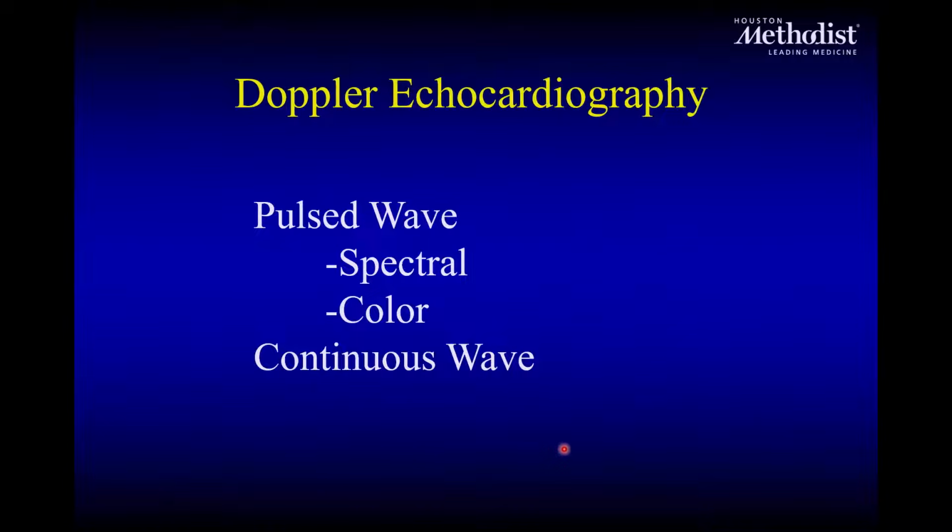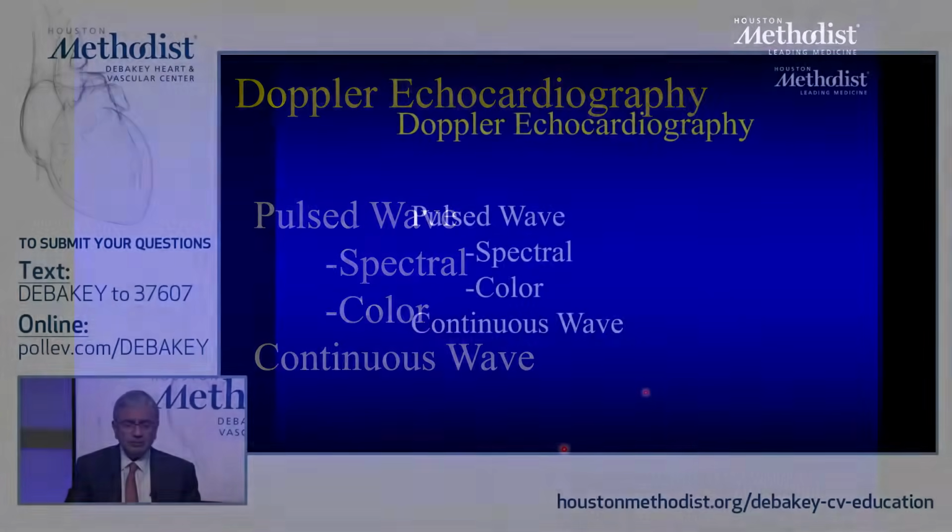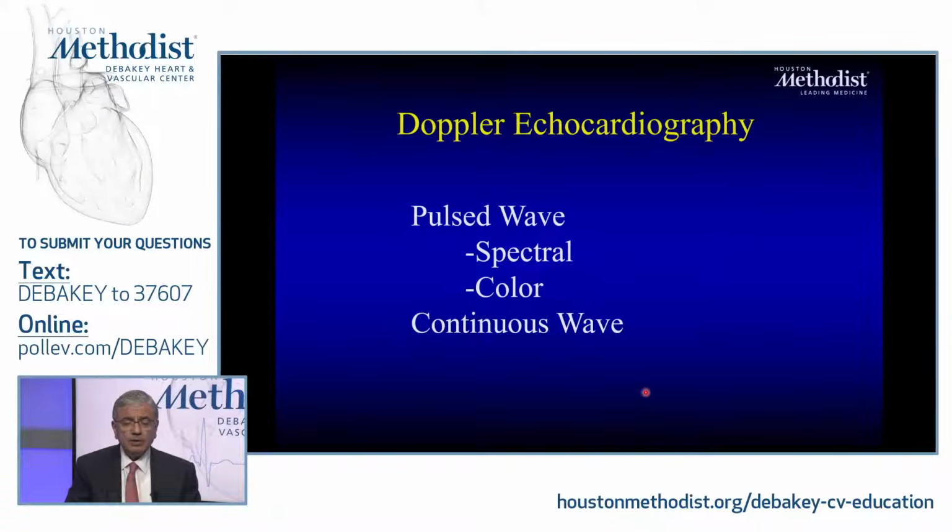So that was imaging per se. We sent packets of ultrasound. We know the reflection of that ultrasound. Calcium will be much brighter than blood, obviously, and myocardium. We know some of the issues that can happen with reverberations, attenuation with this.